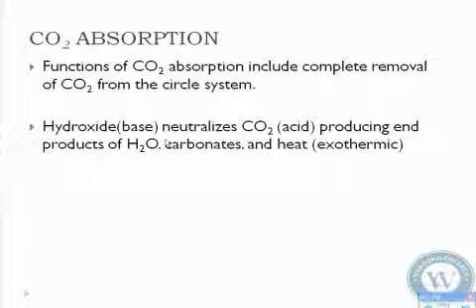All right? And this is one of the first places you should start to troubleshoot. Is my CO2 absorber exhausted? Okay? Is it full? Is it desiccated? Is it dry? Okay?